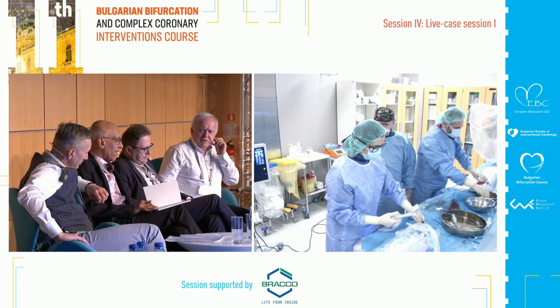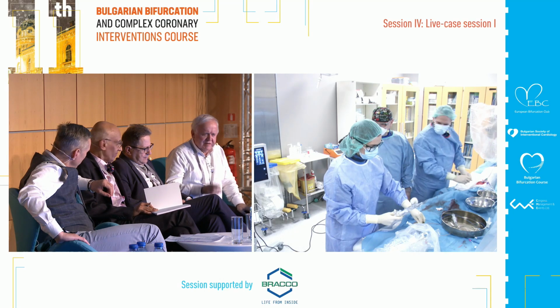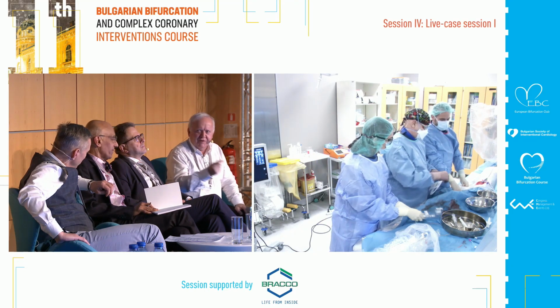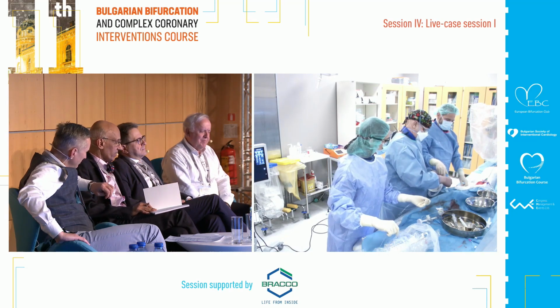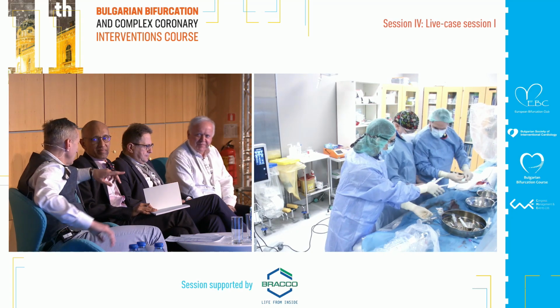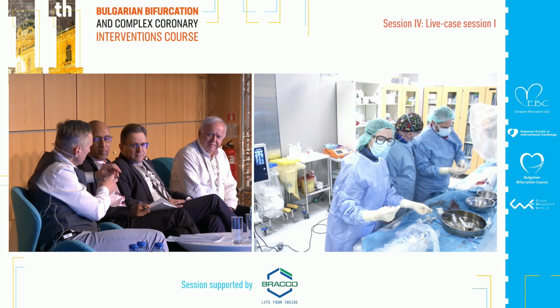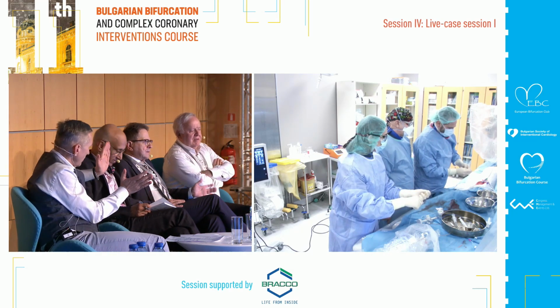Kindly discuss what the downside is in pre-dilating. I think his message is that if you put a stent without pre-dilatation, the stent won't move. That's the idea, I think that's the downside. You think the stent will move? I just wanted to comment on the post-dilatation with a non-compliant balloon: pull it out into the aorta and then flare it. Correct.